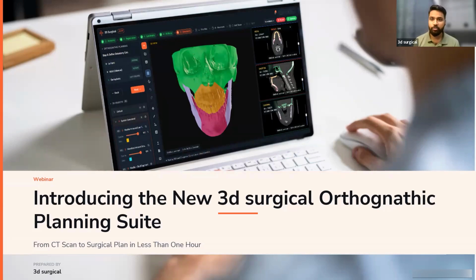Thank you so much for joining and showing the interest for our orthognathic planning module, which is now upgraded with all new features. We'll not just understand about the orthognathic planning module, but we'll also see the end-to-end workflow.